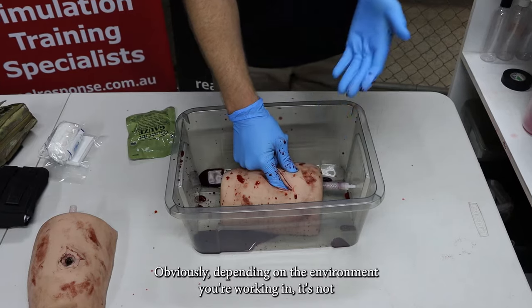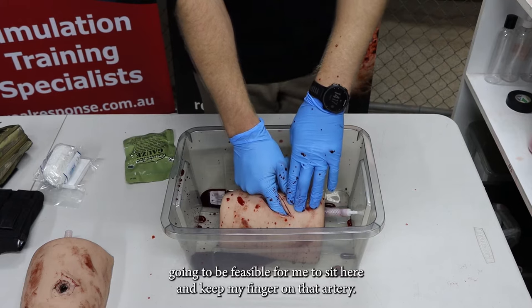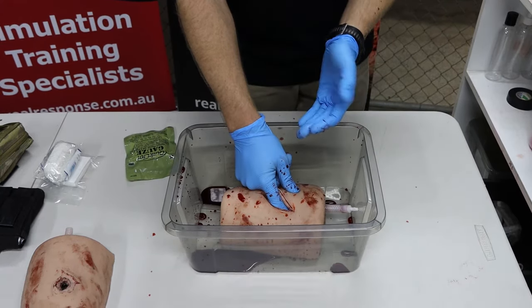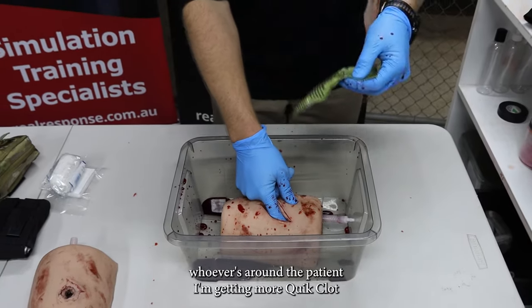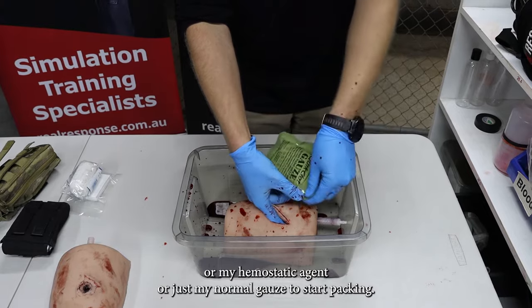Right now I've got digital pressure on that artery which has stopped that bleeding momentarily. Obviously depending on the environment you're working in, it's not going to be feasible to keep my finger on that artery, so what I need to do is start to pack that wound. I'm keeping pressure applied to that artery while my buddy or whoever's around gets the quick clot, hemostatic agent, or normal gauze to start packing.